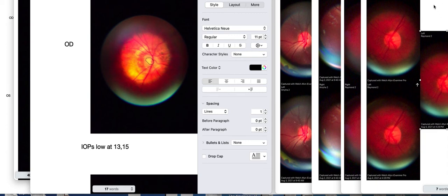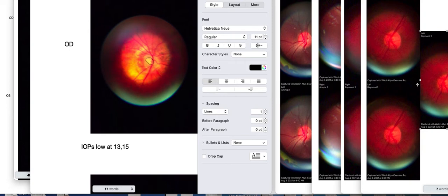Hi, this is Dr. Eric Hussey, and I'm giving you a little bit of information about the new panoptic ophthalmoscope, and in particular, taking pictures with it.